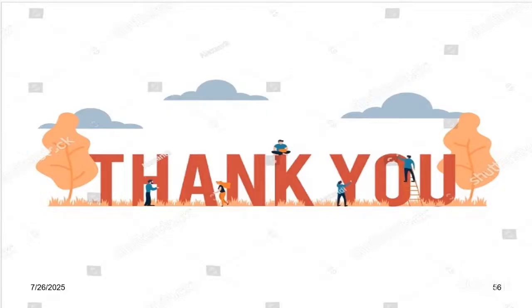She introduced, telling us of the relevant anatomy, and she told us about testing patterns and thresholding algorithms, the different types and the reasons for each of those patterns and algorithms. And then she also told us how a visual field printout should be interpreted. So let me just lay some emphasis here. As she did say, you should make sure that the printout you have in your hand is that of the patient and that the details are correctly inputted. Details in terms of age, sex, any refractive error, any refractive correction used, because this is very important in analyzing the results we obtain.